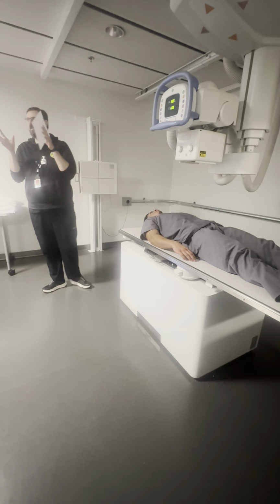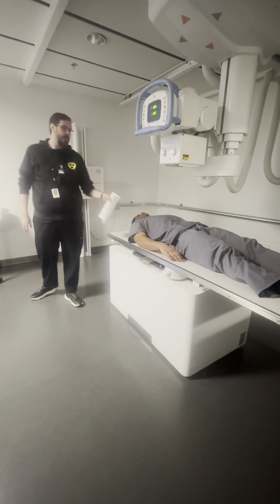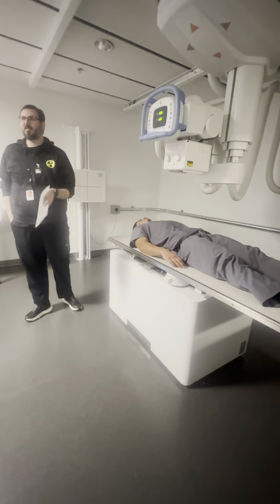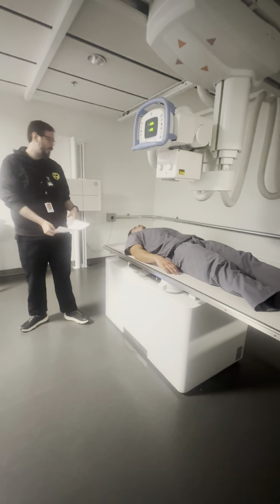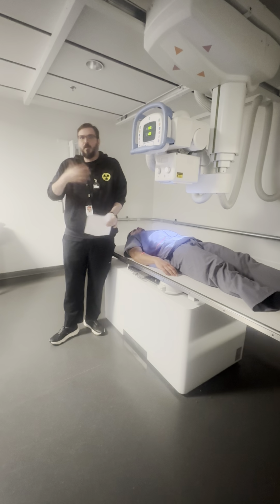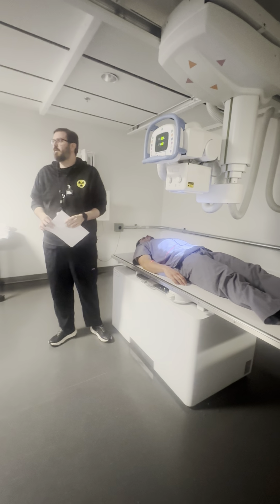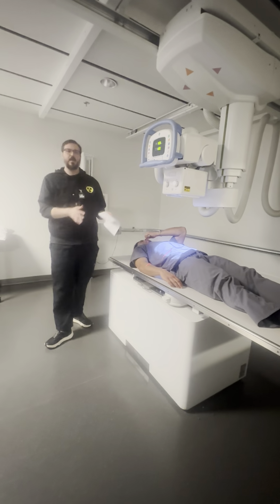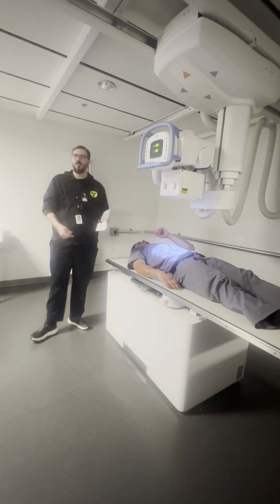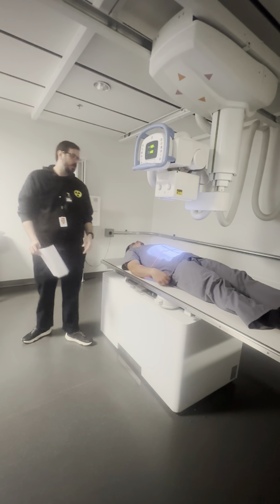Now, this is where, again, practicality versus better image comes into play. They're going to have to be here for a minimum of an hour. Perhaps longer. I've done days with these exams before, right? So, because of that, I'm not going to have him on his stomach, because then we're flipping onto your stomach all day. You're putting a lot of compression on an area that's already painful or distended. So, even though the PA might be the better shot, and Merrill's would say, yeah, you should absolutely do these PA, the practicality says we do them mostly AP, right? So, we're going to do it AP.